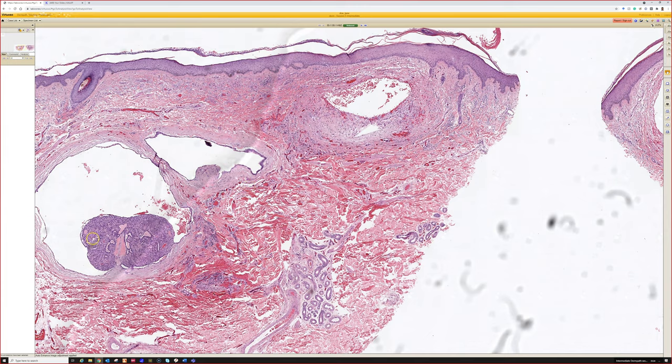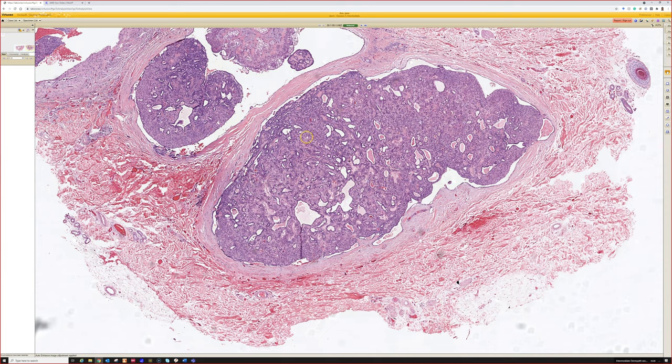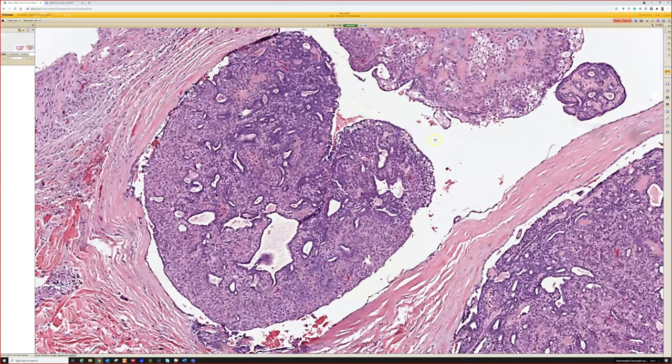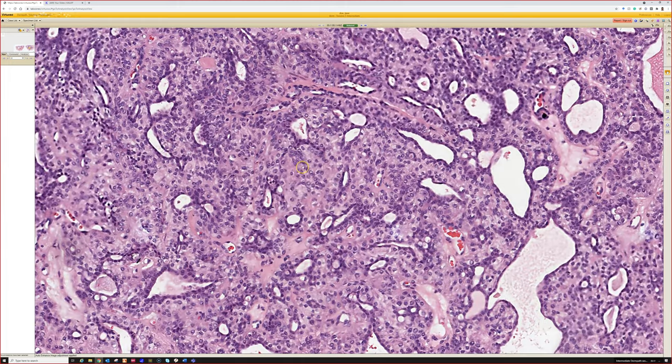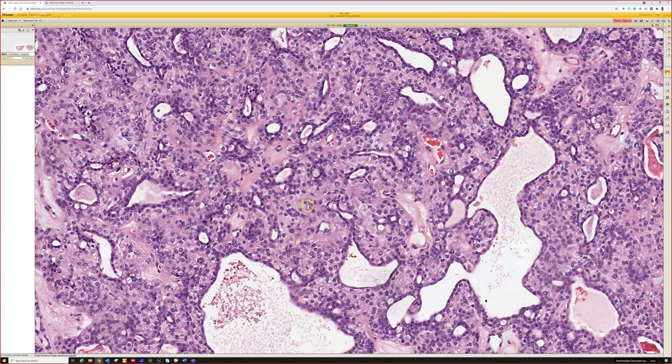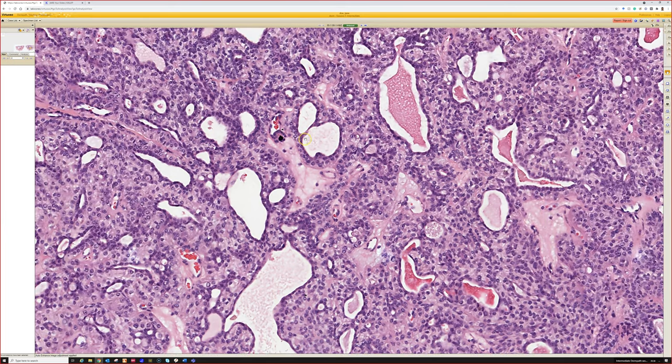All right, and they tend to be seated down in the deep dermis, although sometimes they can actually connect to the epidermis, which I feel like is not taught enough, but I've seen many times in practice. And the cytology of the cells that make up hidradenoma, which is also known as acrospiroma, is the cells tend to be a uniform population and have kind of pink to clear or pale cytoplasm. They kind of look squamoid to me, like keratinocytes because of the abundant pink cytoplasm. And usually we teach there's one cell population, although in this one you can kind of see two because there's kind of an inner lining on some of the tubules.